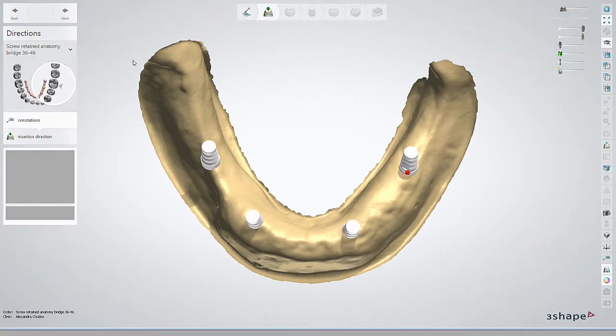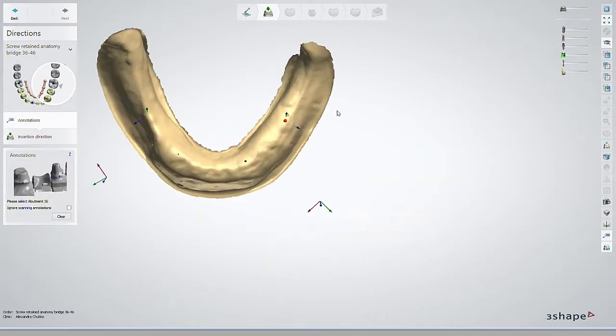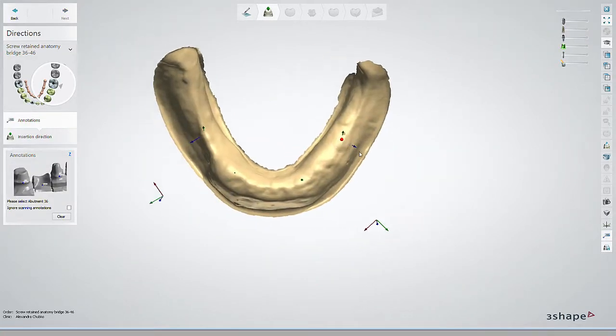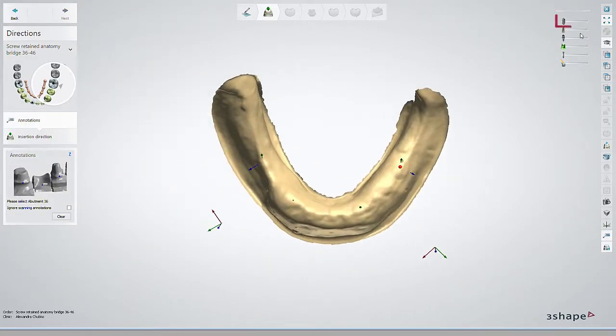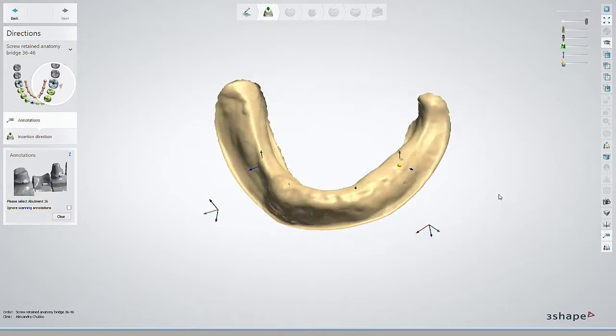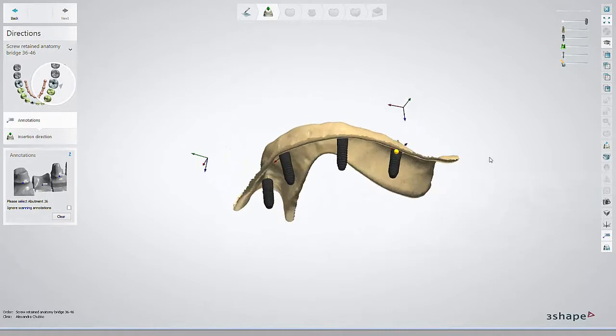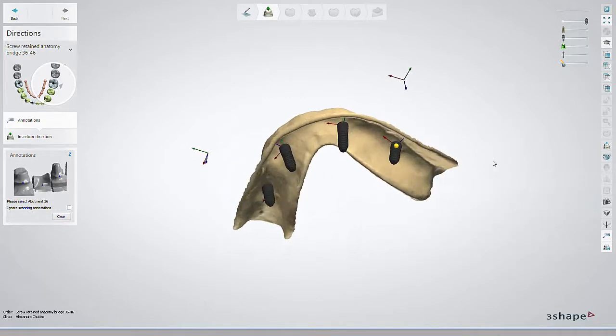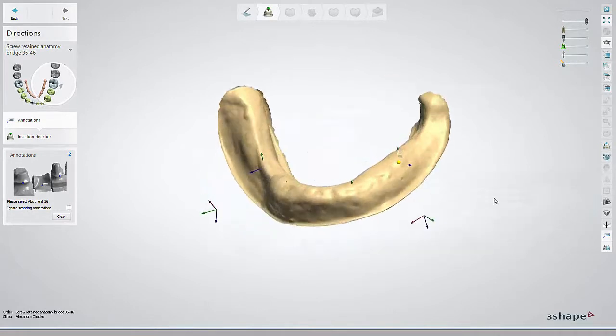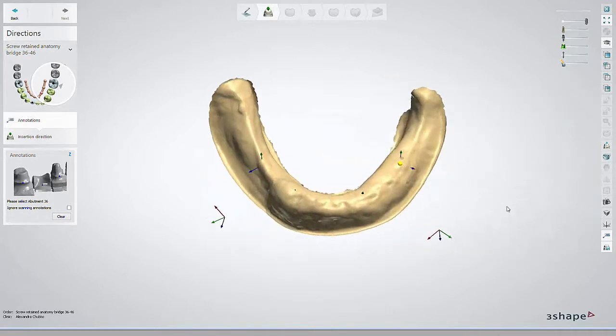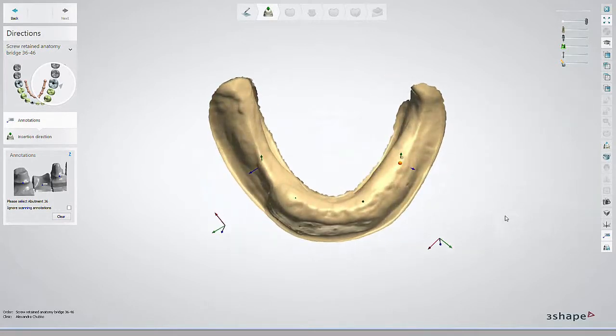Once the case is open, you can enable the implant visualization slider and you'll be able to see the implant position. Proceed by marking the annotations and finalize the rest of the prosthetics design.